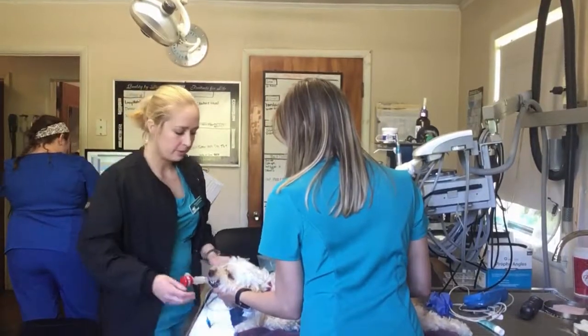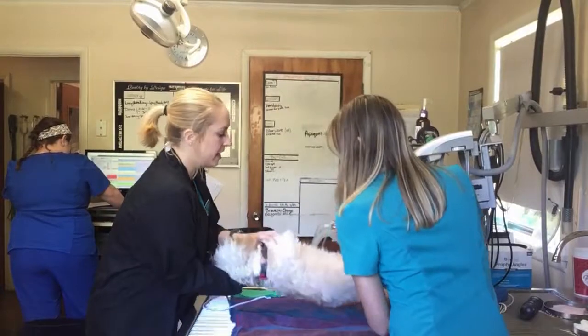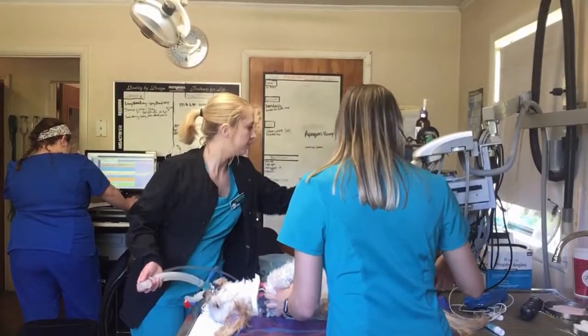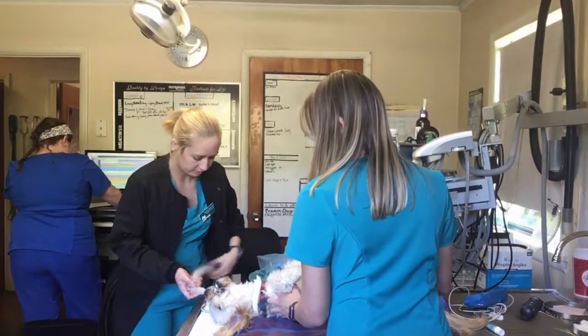So I have my respiratory monitor attached to the end of her tube. We're going to go ahead and flip her on her back for the scrub, and attach her to anesthesia.